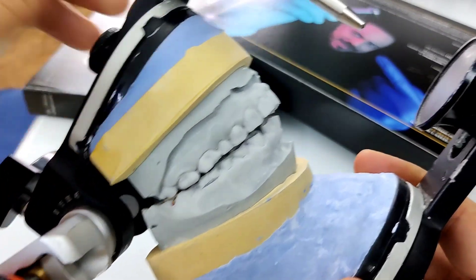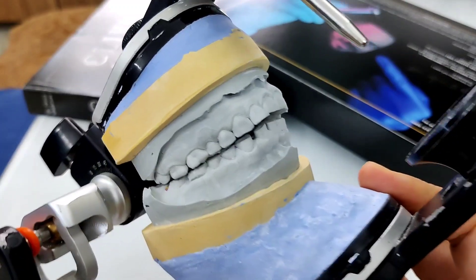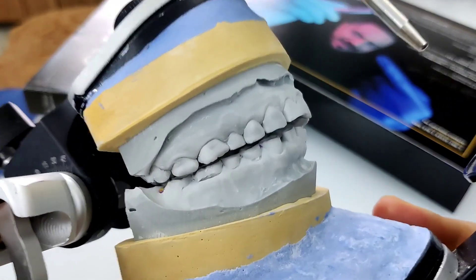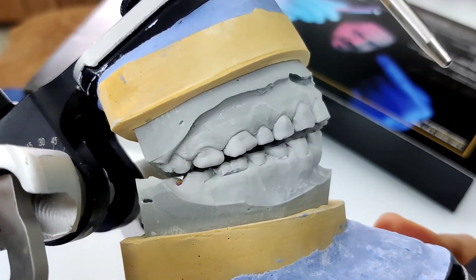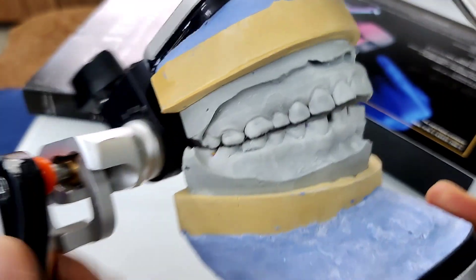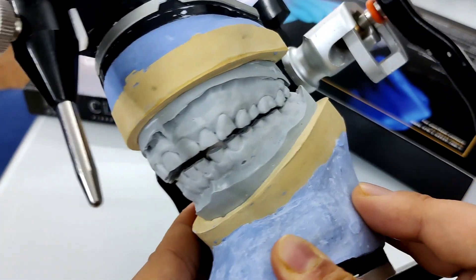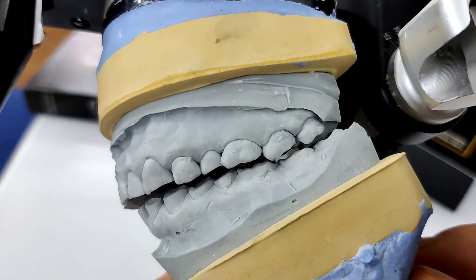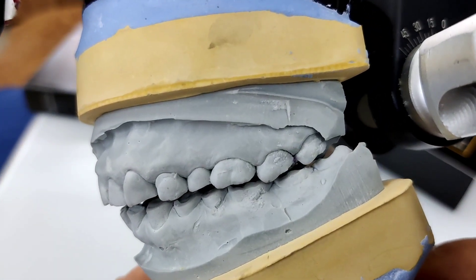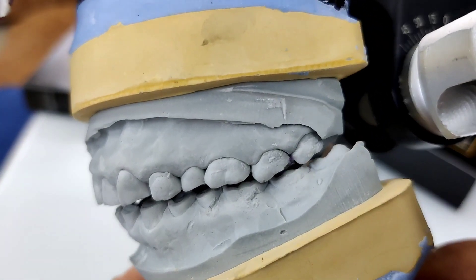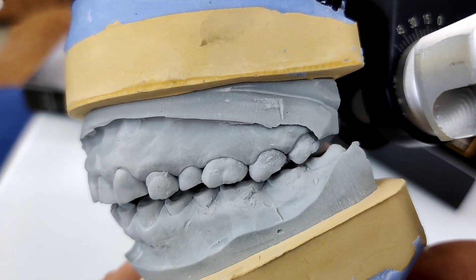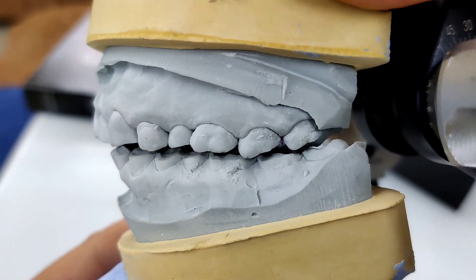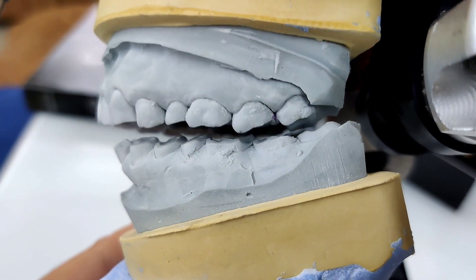As I close down here, you can see that the teeth are definitely not intercuspating. I don't see any contacts on this side. Looking towards the other side, I'm guessing there is a contact here between the upper third molar and the lower second molar — there's a contact right here.